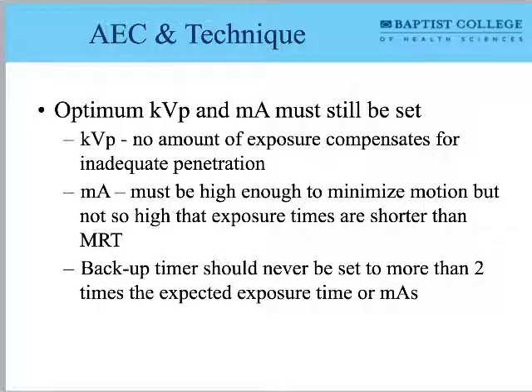The same thing is going on here with the AEC. It needs some minimum amount of time, basically, for it to be on, right? So if I set my mA too high, the problem becomes that I've basically exceeded the screen time of my cell phone, right? It's too much information inputted all at once. Minimum response time. So I could potentially overexpose the patient. That's not really a problem, though. In all honesty, that is more academic than anything. I don't think we need to know how to calculate minimum response time or anything like that. I don't want to get lost in the weeds.